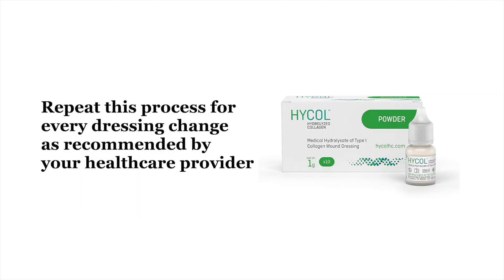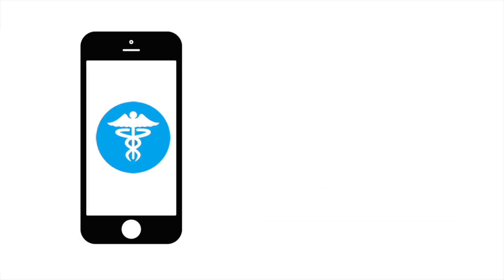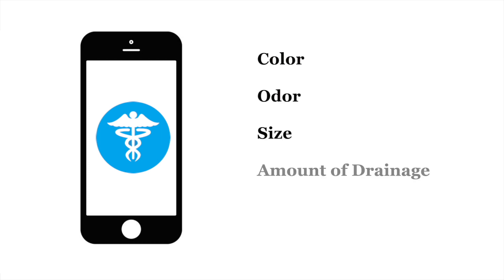Repeat this process for every dressing change as recommended by your health care provider. Remember to notify your health care provider if there are any significant changes in your wound, such as color, odor, size, the amount of drainage, or any level of discomfort.